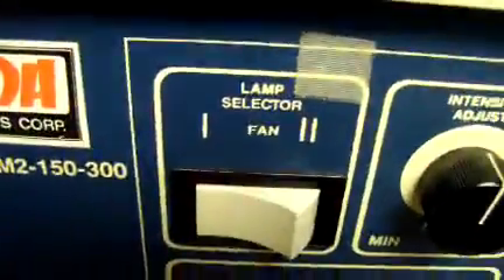We'll turn it on. As you can see, lamp one is selected.